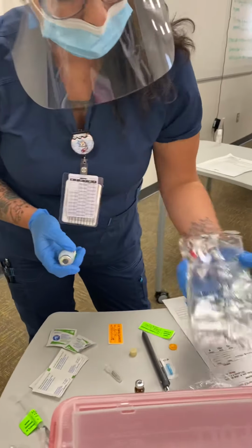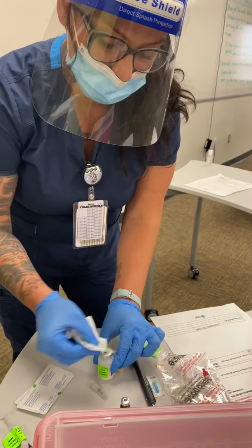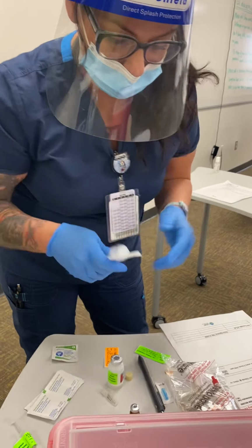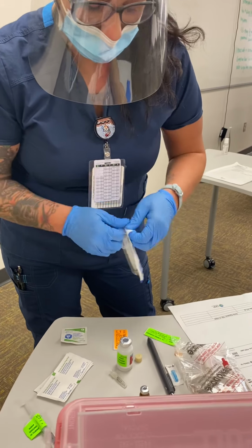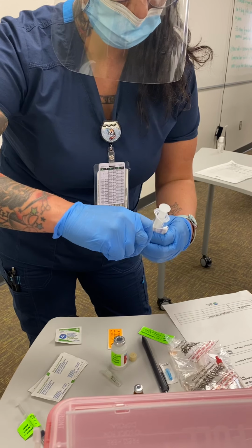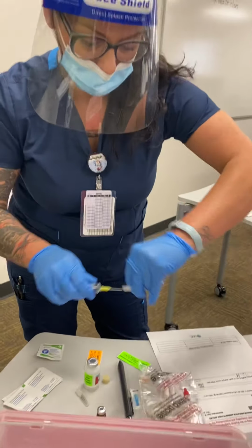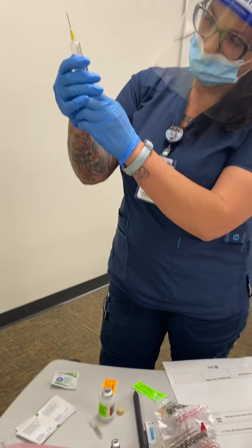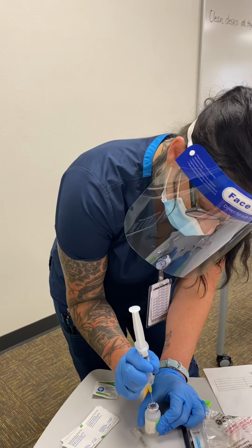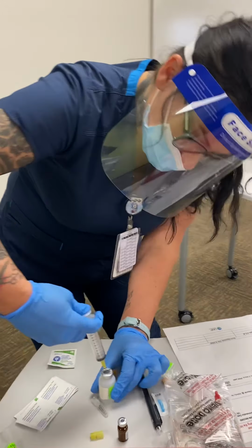Everything matches. My normal saline matches. Pop the top. I would clean, clean, clean, clean, clean for 15 seconds. And get my 10 ml syringe. While that's drying, withdraw 10. All right, so the alcohol just dried, so it's safe for me to inject. All right.